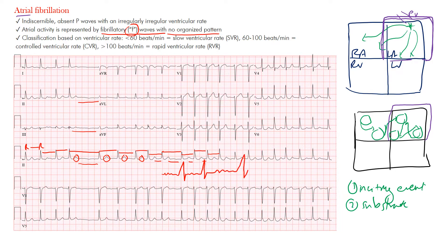Sometimes you can have small waves between the QRS complexes — little fibrillations. Depending on their amplitude: if those fibrillations are more than one millimeter in amplitude, we call that coarse atrial fibrillation. If they're less than one millimeter, we call it fine atrial fibrillation. And if the baseline is essentially flat, like we see here, we call this isoelectric.